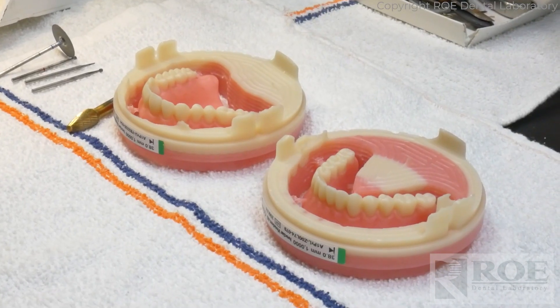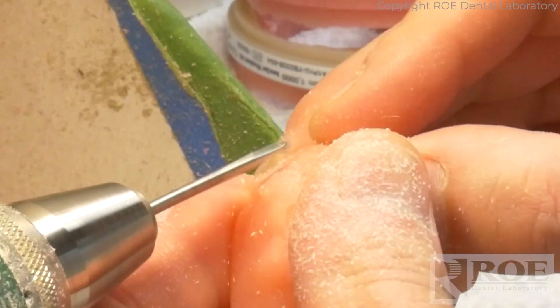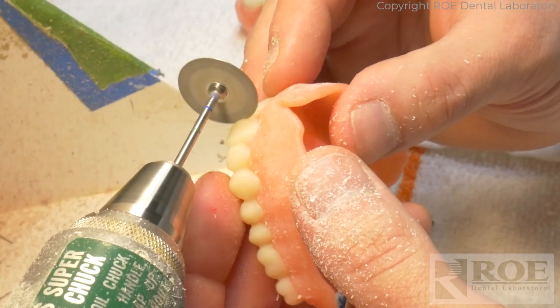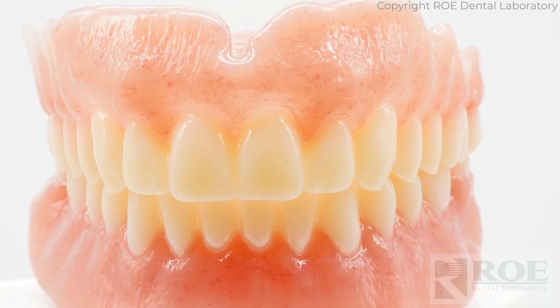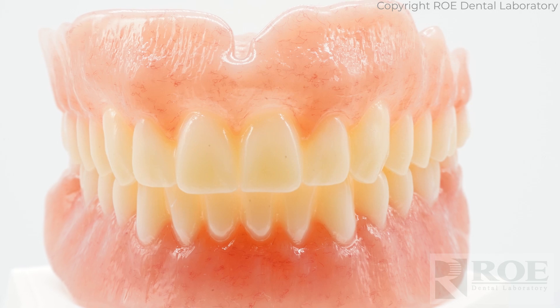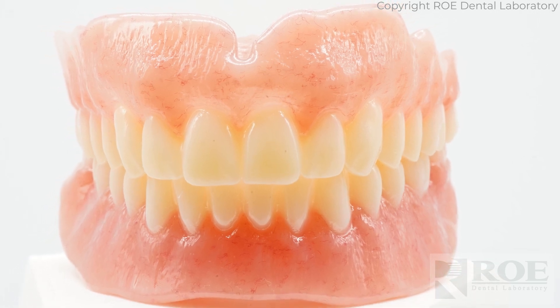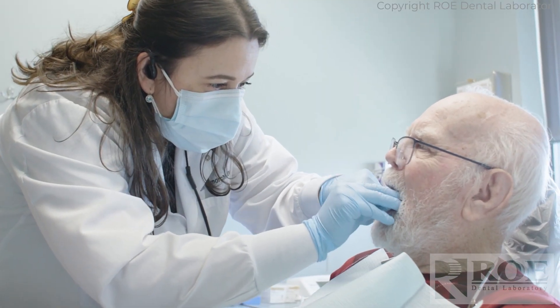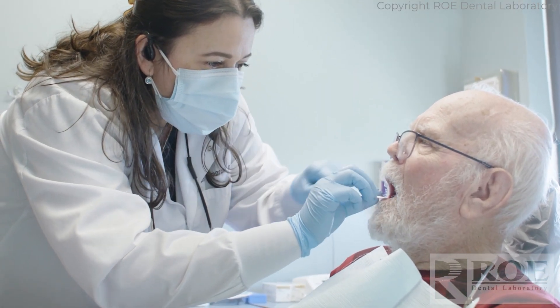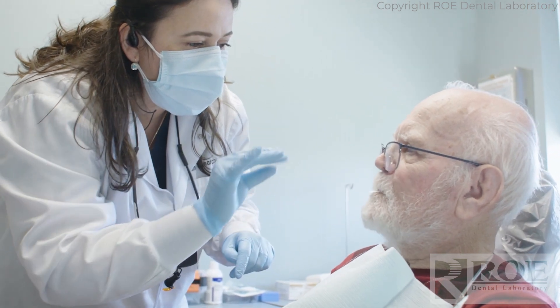When I saw the iVotion denture and opened the box, I was really happy. They look natural — the pink acrylic, the gum even has some texture to it. I couldn't wait to see them in Elmer's mouth. Today's delivery appointment was very easy: put the dentures in, check the bite, check for pressure points. We typically do that with any denture we deliver, and we'll continue to follow up for any necessary adjustments.